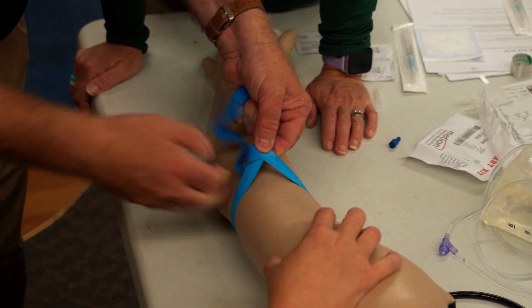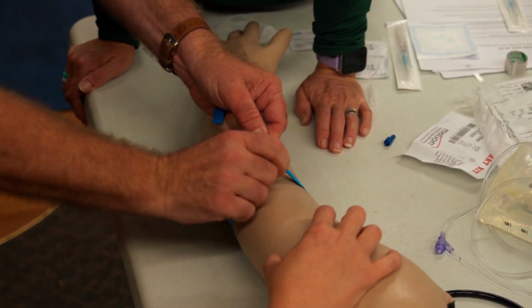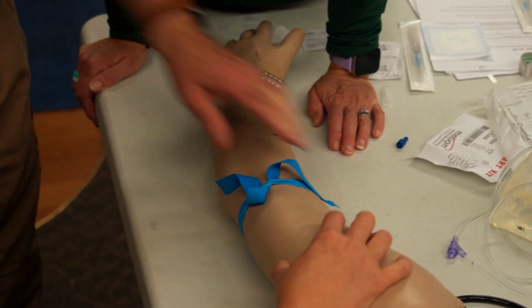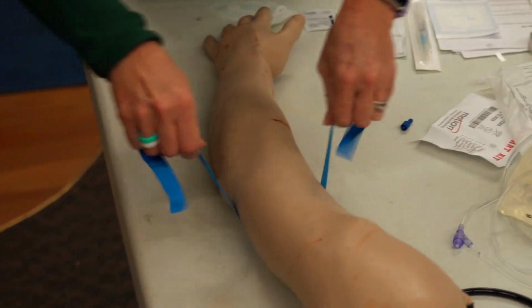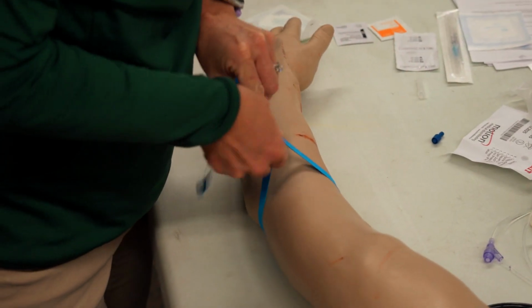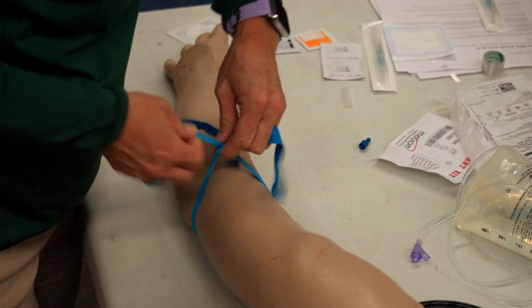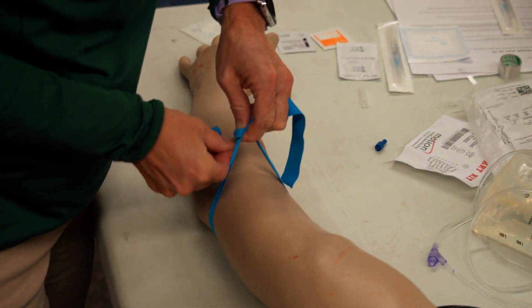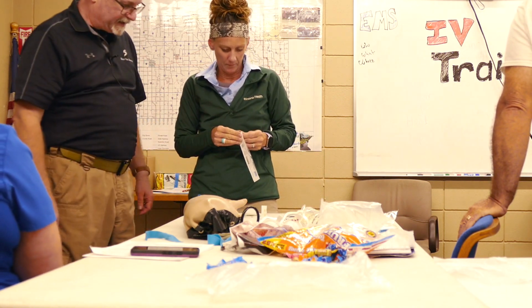So I still got the tension. We can just tuck it under there a little bit. Doesn't have to be perfect, but at least there's enough. Trust me, you just have to do it a lot. So one of the pieces here tonight is you need a more supervised time before you're really doing it. You're doing great. Your gloves are on. Have you wiped off your stuff?